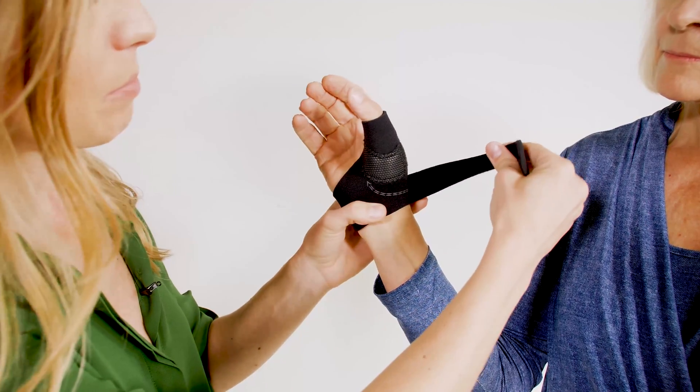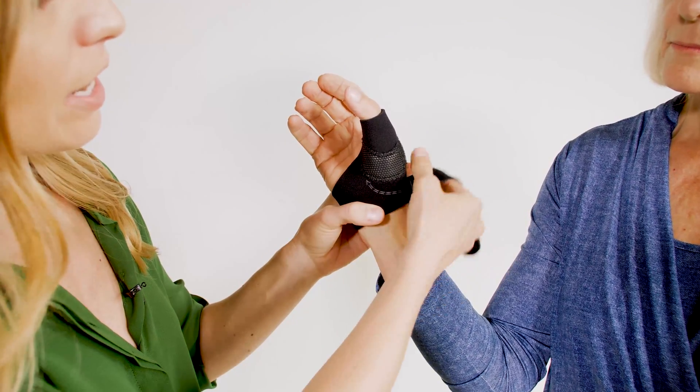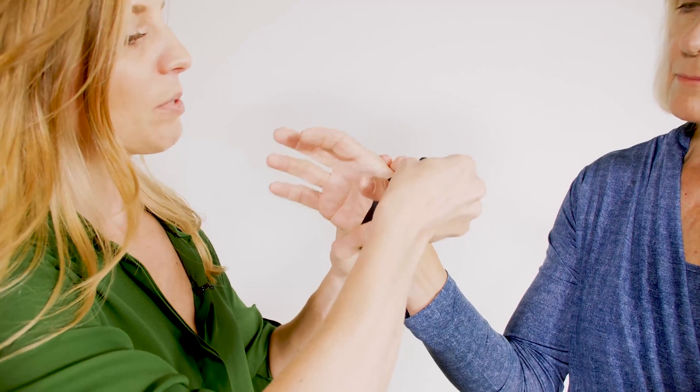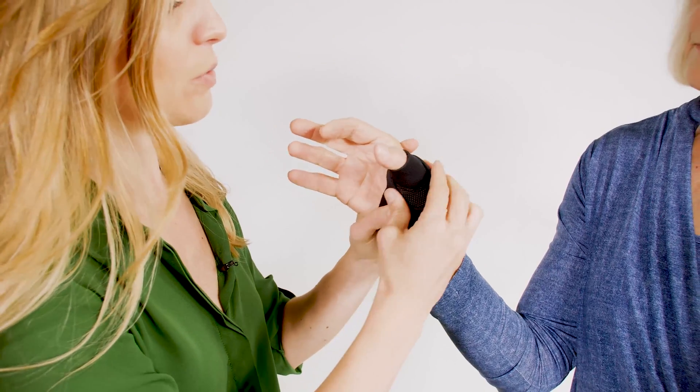Next I'm going to grab the sling strap. I'm going to come around following the indicator arrow, capture the CMC, up through opening the web space, finally closing the strap down.